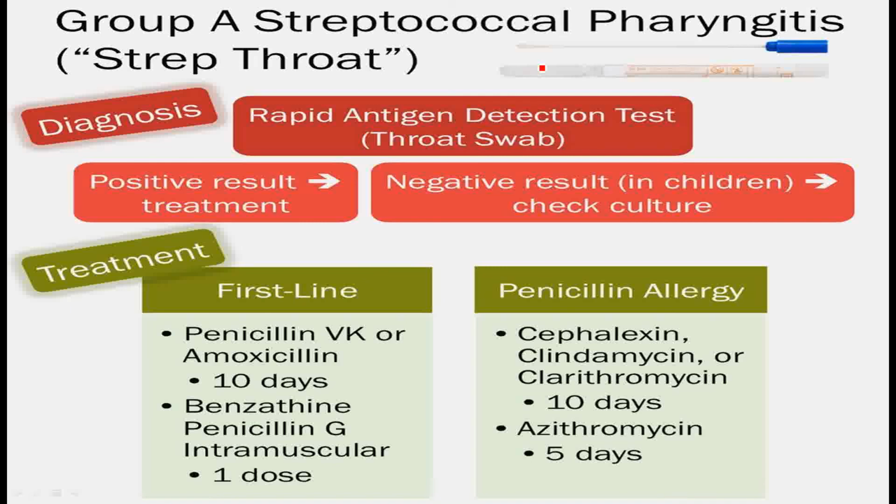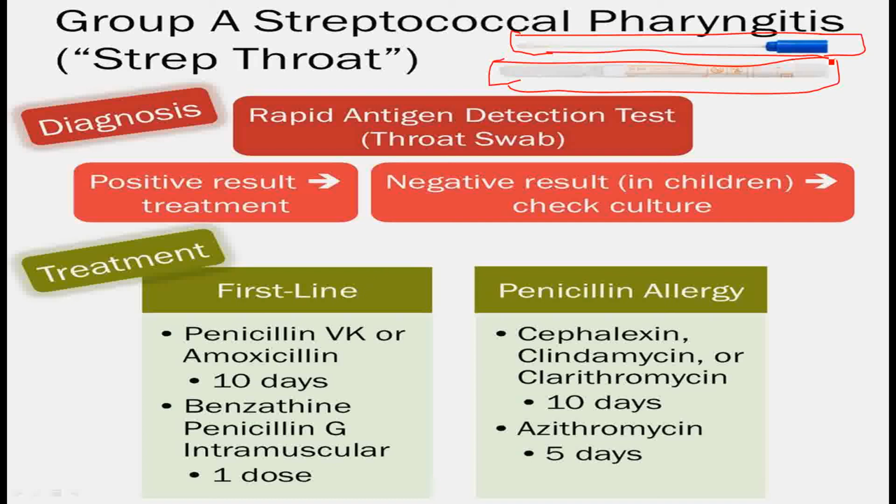You can see here these are instruments used in the collection of specimen from the patient. Although these are not very clear, but still you can visualize them. These both instruments are in the box now. You can easily see.